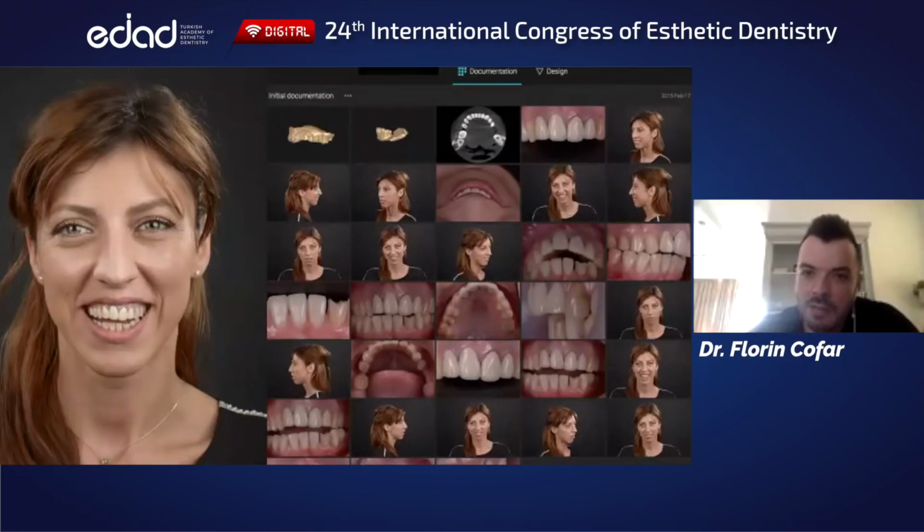Whenever your case is complex, you're going to have multiple stages. So in traditional thinking, at every stage, as you modify something big, let's say you do the ortho or you're going to do grafts or tissue or whatever, you need to redesign according to that situation. So most of the time we're used to using design as a reactive tool to how the case progresses.